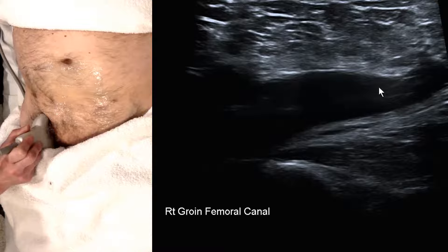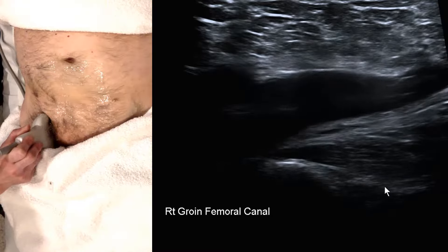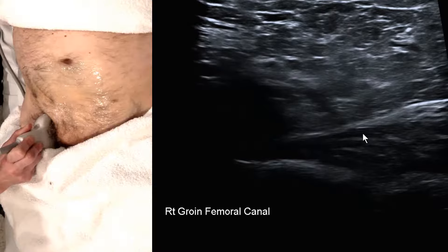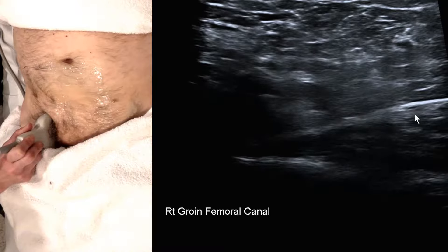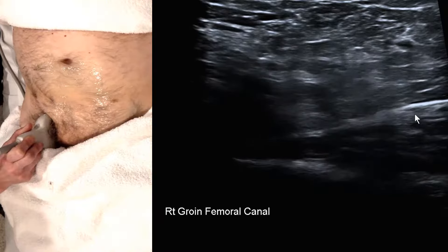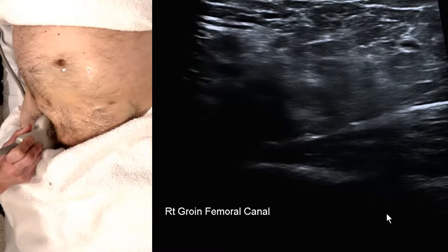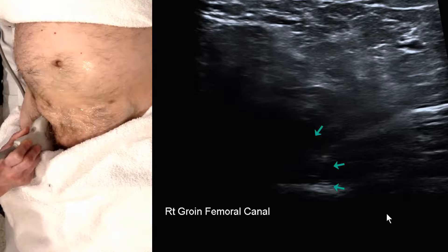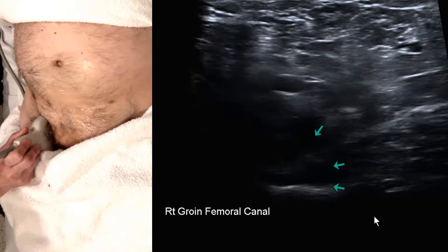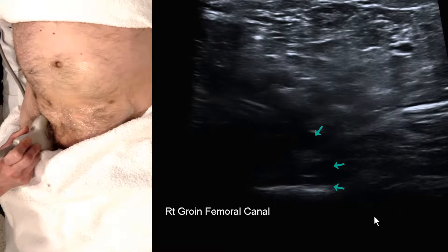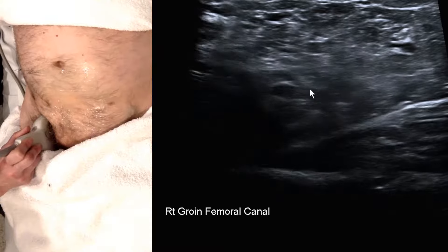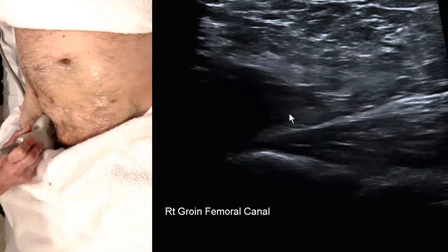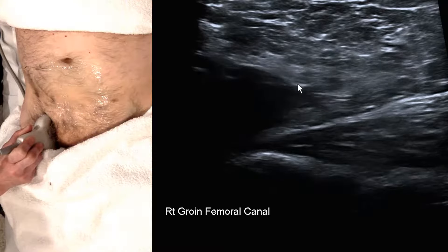Down to the level of the SFJ — if something travels that far, it means it's moved two to three centimeters below the pelvic rim, therefore there is a hernial defect or orifice. With the patient straining, we can see movement at the level of the pelvic rim. There's a little bulge as the peritoneum sags down, but it's being held in by a little cribriform fascia which reinforces this point of the femoral canal.